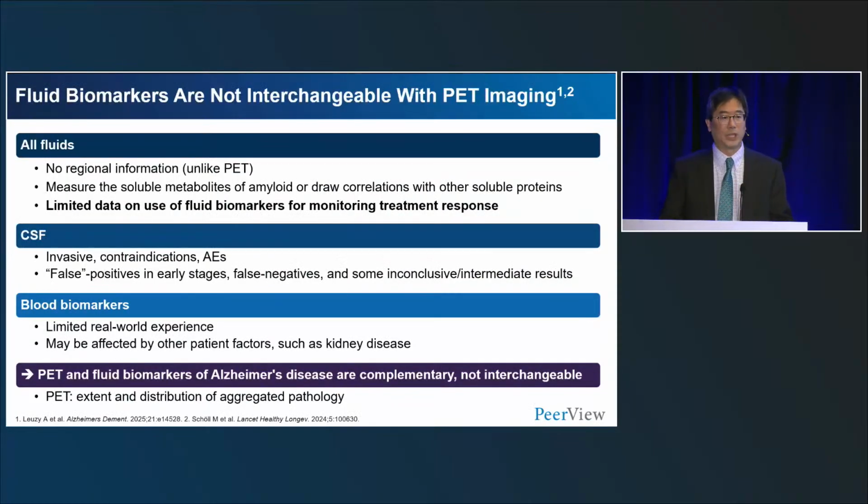We get asked a lot about how this increasingly important field of fluid biomarkers works with PET imaging. Well, there are some important differences.